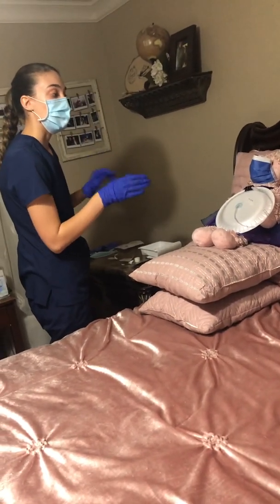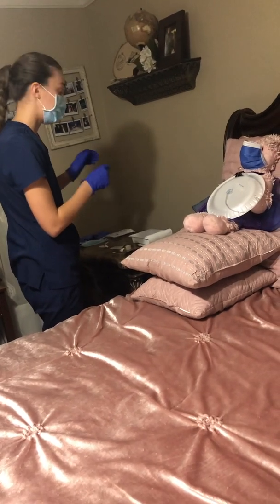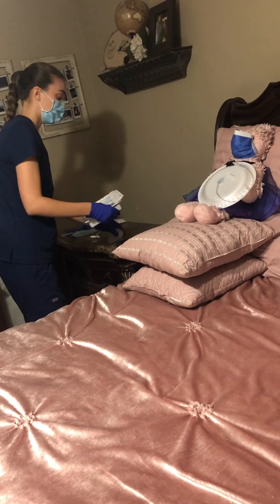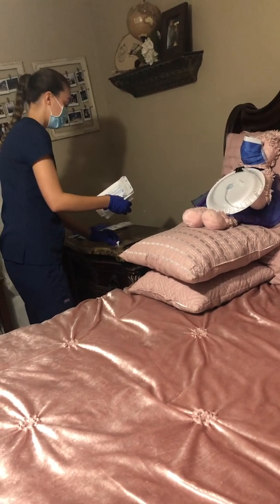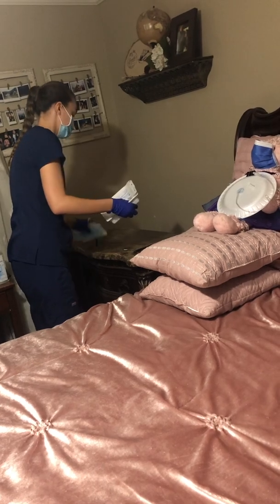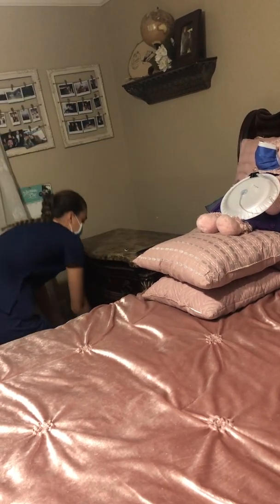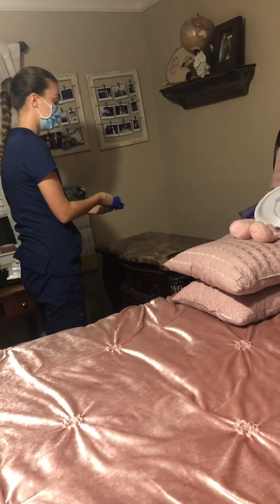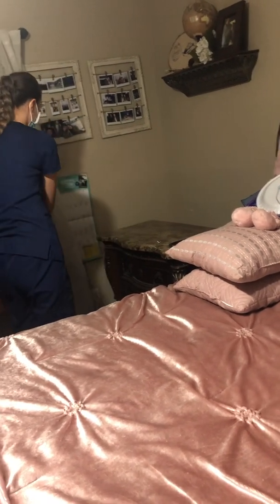Alrighty, Mrs. Jones, I'm going to go ahead and clean up my station. How are you doing? Good? Awesome. No pain, discomfort? Perfect. Let me know if you have any questions. Discard those. Take off my gloves. Perform hand hygiene.